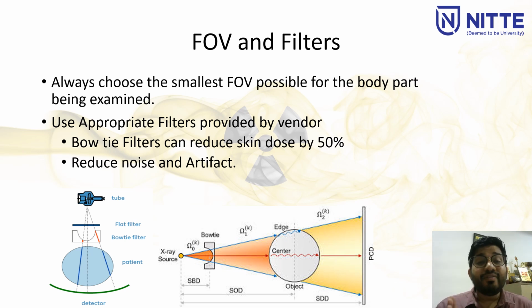A display field of view is used during that particular brain imaging, if you want to get a cut section from the orbit or paranasal sinus or any other part within the brain region that we are already covering. There you can keep an additional display field of view, changing the window width, window level, and filter. You can keep a separate display field of view, so it will be reconstructed and you get the image.